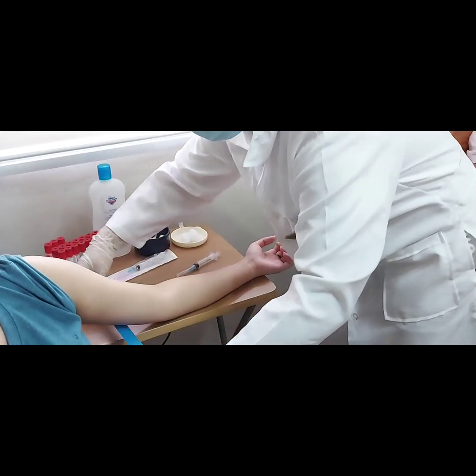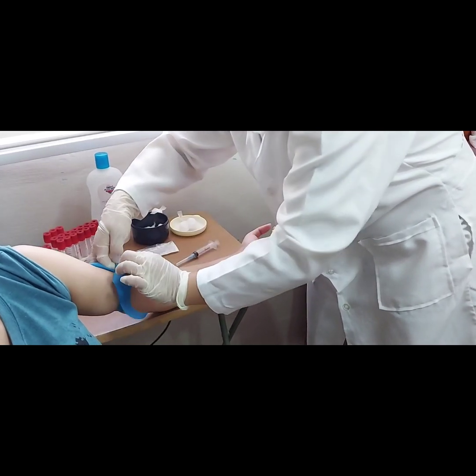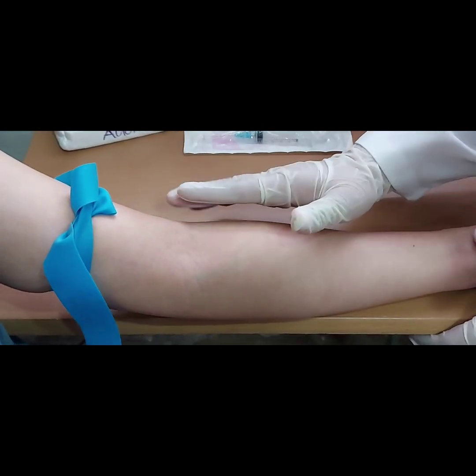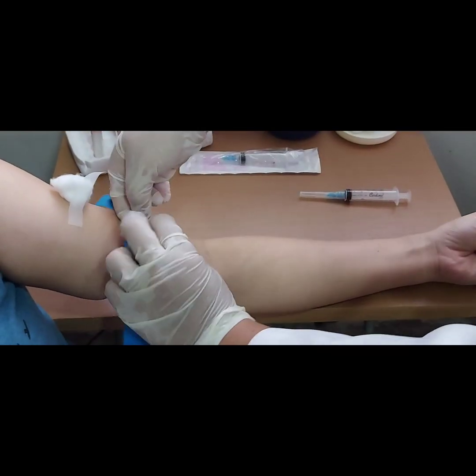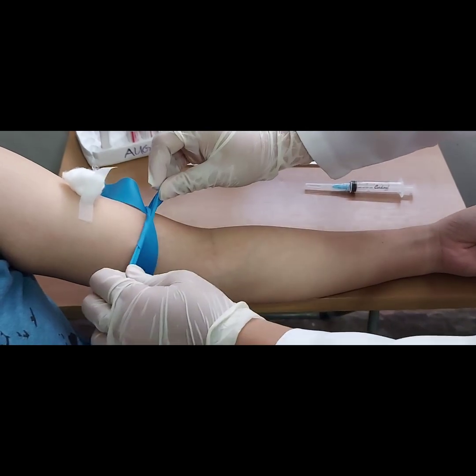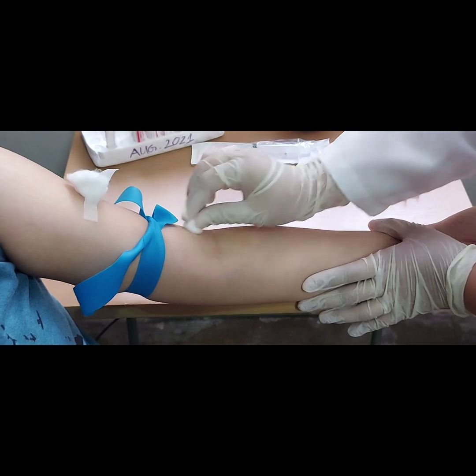Put on the tourniquet on your patient's arm. Tell your patient to make a fist prior to collection. Palpate the vein of choice. Prepare the arm of your patient by putting on the tourniquet. Disinfect the site of collection with your wet cotton balls and allow it to air dry.